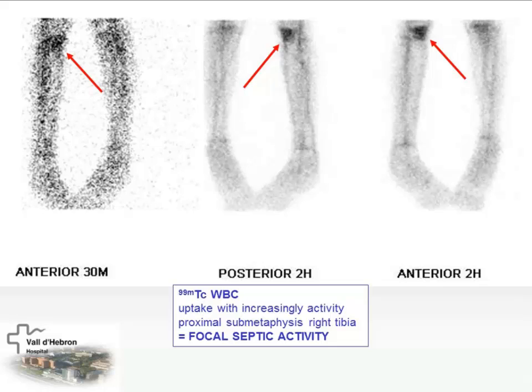Is there a reactivation? Yes, where? In all the diaphyses? No, just in the submetaphyseal region. Okay, this uptake indicates a focal septic activity in this chronic osteomyelitis.